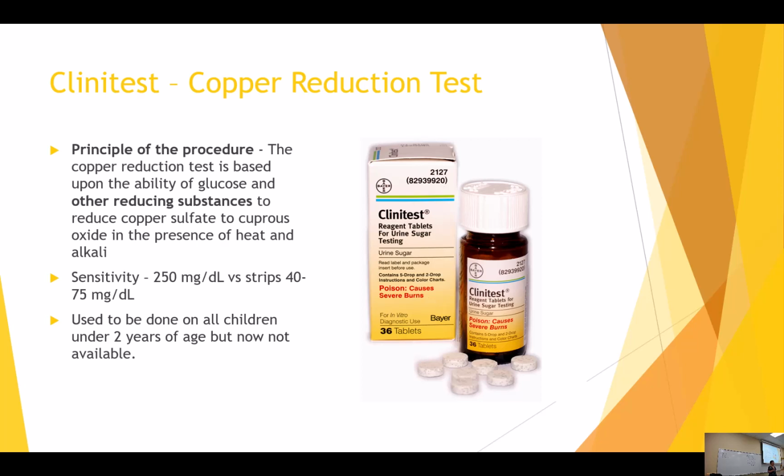And what you would see, and it's a common case study, it might be a board question: the glucose is negative on the strip, but the Clinitest is positive. And if you look, it's a young child and they have galactosemia, for example, because galactose is one of those sugars that does not get picked up on the strip, but does get picked up with Clinitest. So it's a really great board question as a contradiction. What is wrong with this? Where are your contradictions? What's happening? Clinitest is positive, but the glucose strip is negative. It's looking for other reducing substances.